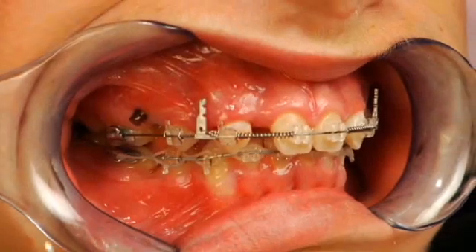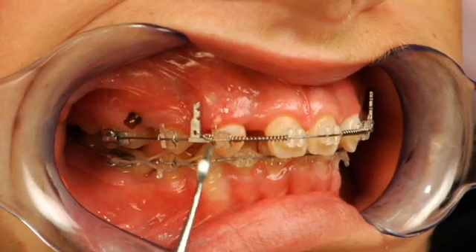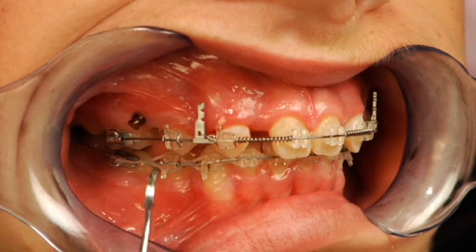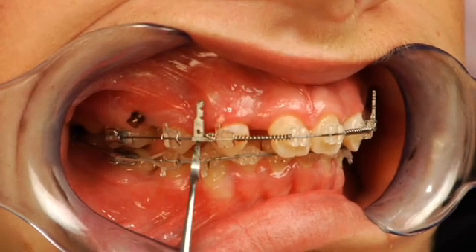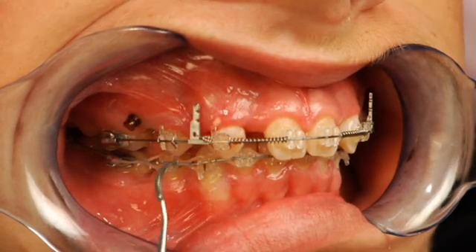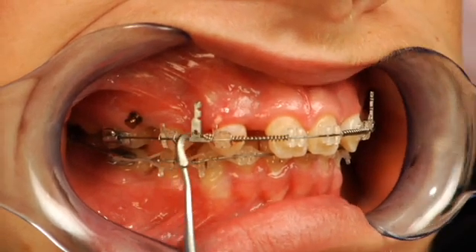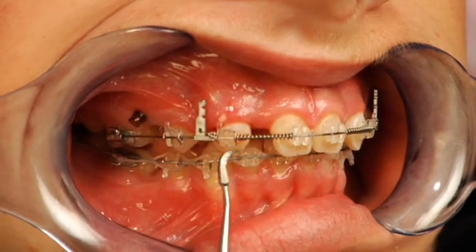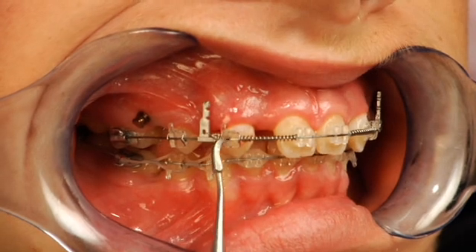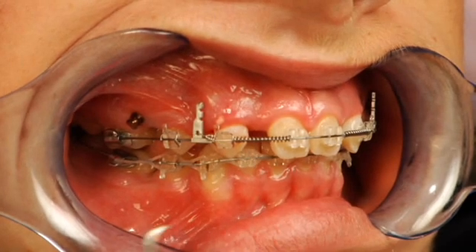At this point we've placed a full-size rectangular arch wire to maintain the occlusal plane and avoid buckling of the arch wire as we apply the retraction forces. We've also placed a sliding post onto the main arch wire. This post is configured to slide on the arch wire, and we've ligated it with a metal ligature up to the cuspid just mesial to that — which will allow us to retract the cuspid and close space while at the same time opening space for the missing lateral.